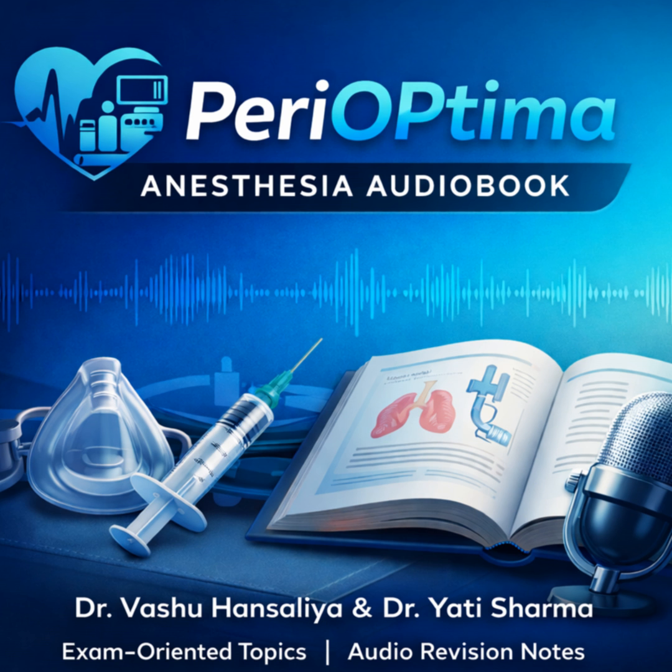Which is the end, the stop button. The stop button, exactly. What tells the machine to stop pushing air in and let the patient exhale? Is it because a set volume has been delivered? Then it's volume cycled. Is it because a set amount of time has passed? Then it's time cycled. Or in some modes, is it because the patient's inspiratory flow has dropped to a certain level? That would be flow cycled. Trigger, limit, cycle: start, sustain, stop.